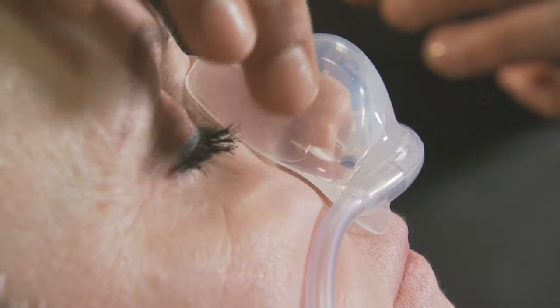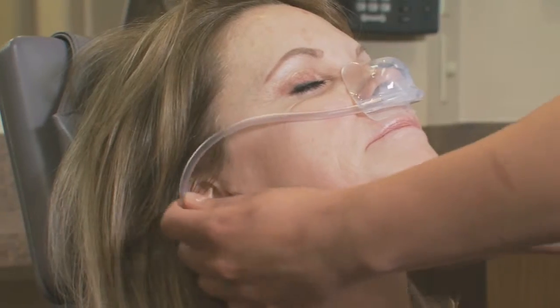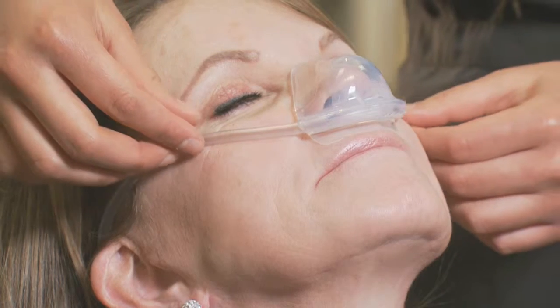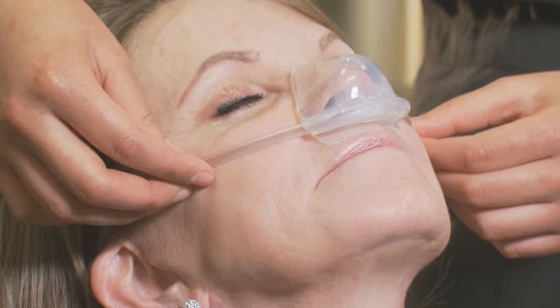After you've sealed the adhesive, grab each tubing for the right and left ear and slide them over the ears together. Secure it by sliding the bolo up to the neck. The last thing you can do is slide the tubing down away from the eyes just for comfort.